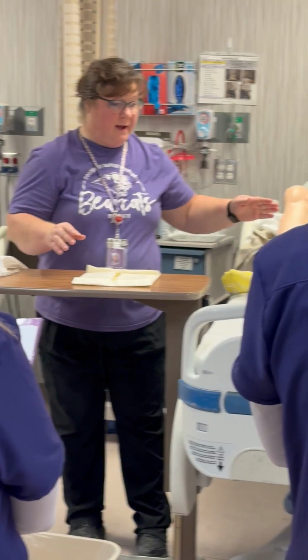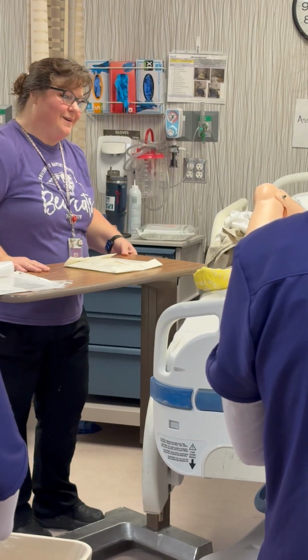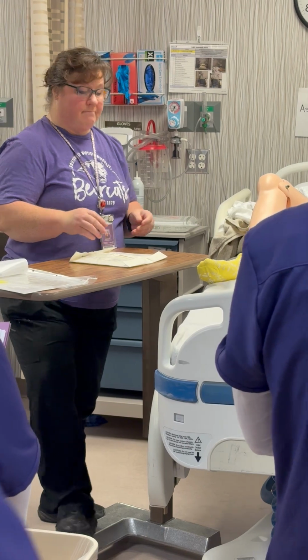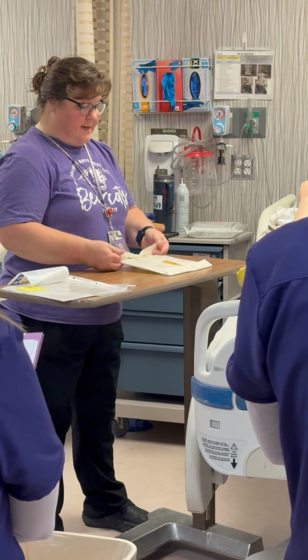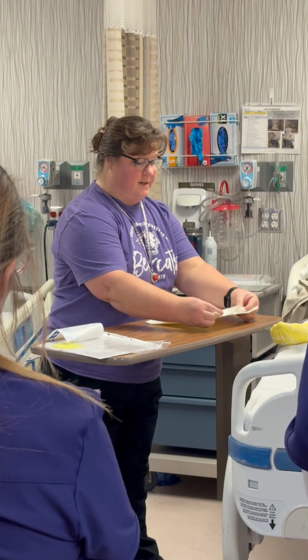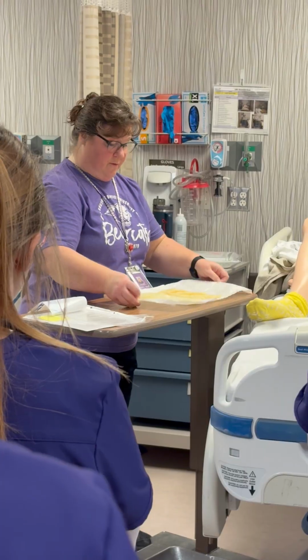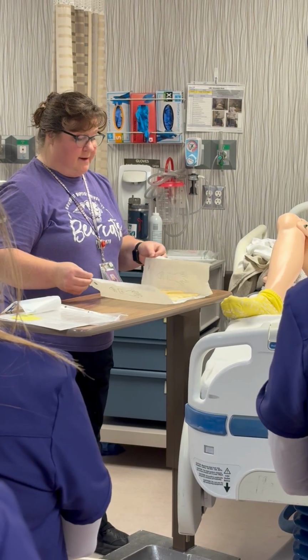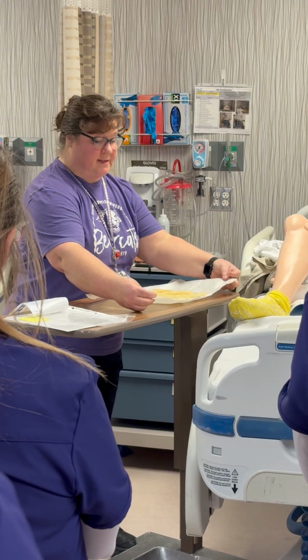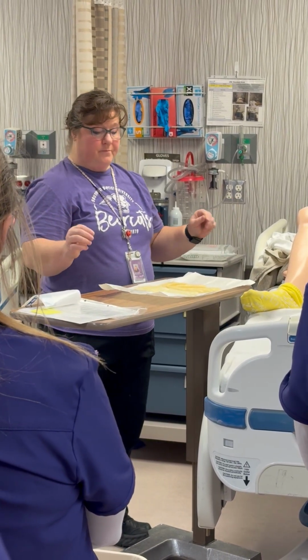So, am I sterile? No. Make sure you've got your eye on there when you're doing this, okay? So, I'm going to open these up, keeping my eye on my sterile field, keeping my 1-inch border for my gloves. Sometimes this will fold back on it. That's why I always try to make sure you guys fold this open like this so it will stay nice and open for you, okay?